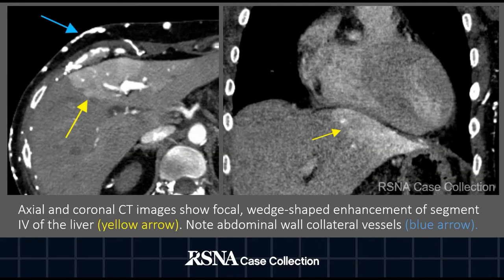An axial slice from the contrast-enhanced CT image of the abdomen in the arterial phase shows a focal wedge-shaped enhancement of segment 4 of the liver, labeled here with the yellow arrow. In addition, multiple collateral vessels can be visualized by the blue arrow.